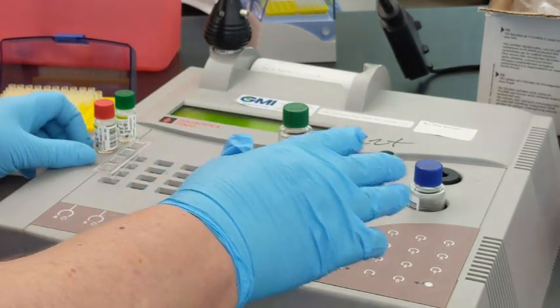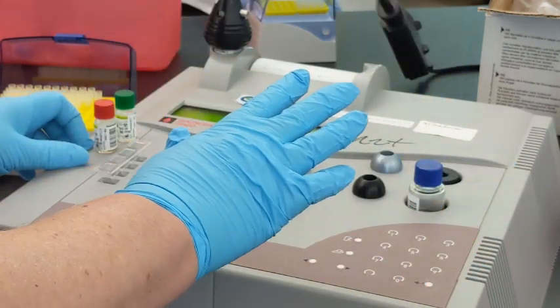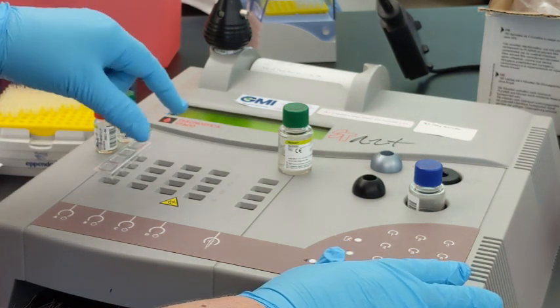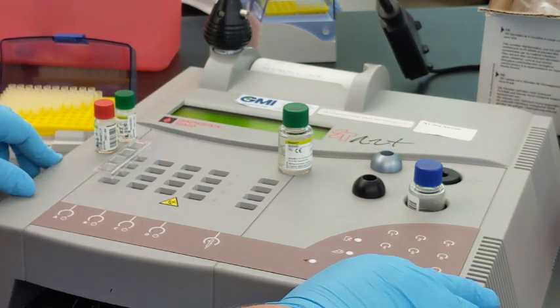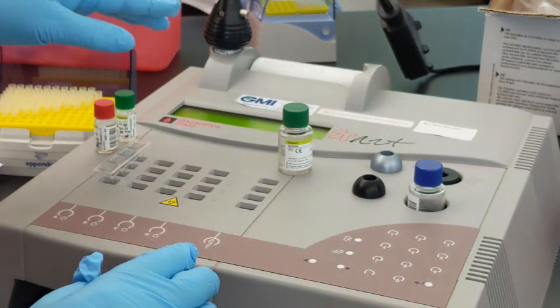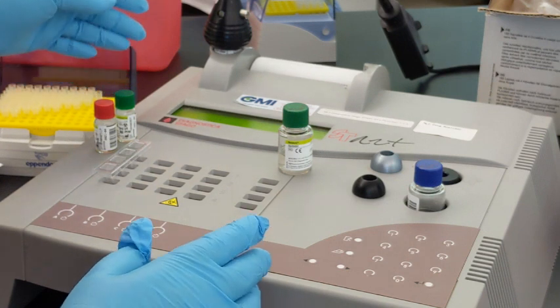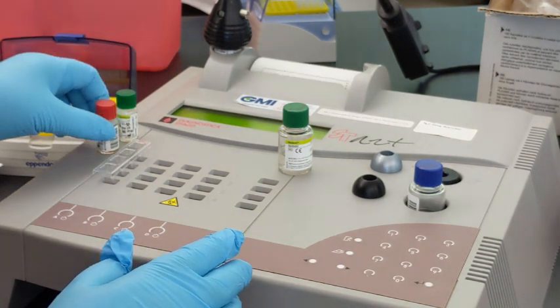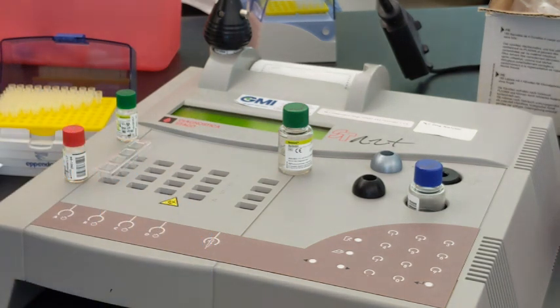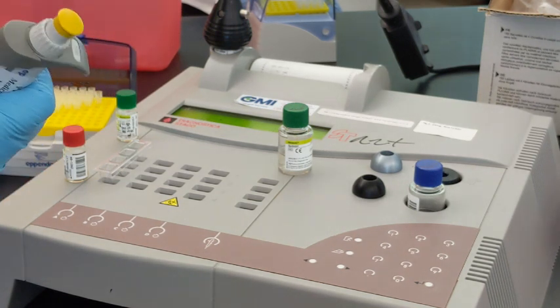I'm not going to show you any patients today, but you would do something with their medical record so you know what patient is associated with which cuvette spot. So now the computer and analyzer is setting itself up so it knows what test we're going to be doing and what samples are going to go into what cuvette. And so for this test we are using 50 microliters for each of the steps.